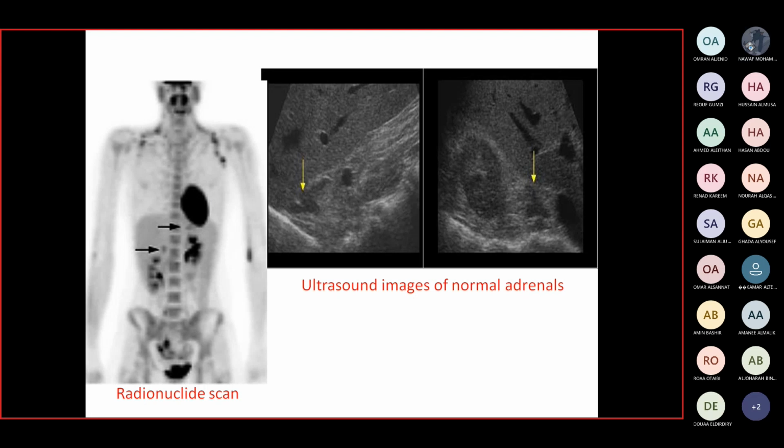Are those sinuses, doctor, or thyroid gland? Yes, this is thyroid gland. What is this imaging technique? Ultrasound. You can see this is the adrenal gland.